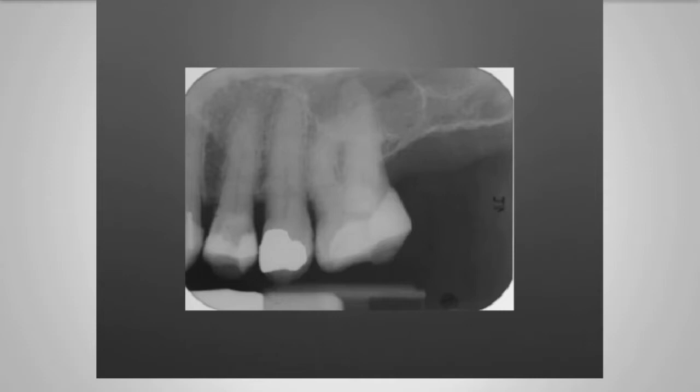But modern instruments like WaveOne Gold will easily negotiate a curve such as this, as long as they've got a path to follow. You need to use lots of irrigant to make sure that dentine chips that are being created within the root canal system are flushed out of the root canal and into your access cavity. It's much easier to remove dentine chips from the coronal area than it is from down in the root canal.